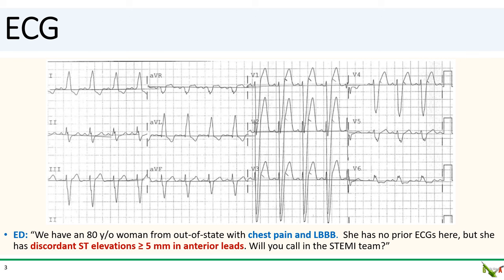They mention something about Sgarbossa and ask you whether you want to call in the STEMI team for an emergency cardiac cath. You look at the ECG and the ED is right — the anterior ST elevations are clearly more than five millimeters. So what should you do? Should you call in your team on Christmas Day?